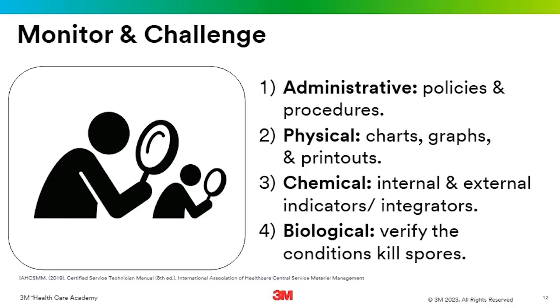So, you get your printout and you're supposed to look at it and you sign it and you date it or whatever the policies and procedures are in your facility. Some people don't even see their printout because it's all paperless and it goes right into their electronic tracking system. But when you look at that printout, do you understand what you're looking at? Do you know that you're checking for exposure time, dry time if necessary, temperature, pressure? Can you pick out where the pressure is happening and the pulses are happening demonstrated on your sterilizer printout? These are all abilities that come with interpreting physical monitoring.